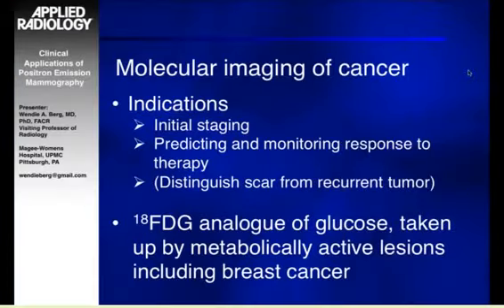Today, we're going to talk about molecular imaging of cancer, and specifically breast cancer. The indications for this include initial staging of women who have newly diagnosed breast cancer, predicting and monitoring response to treatment, and finally distinguishing scar from recurrent tumor.